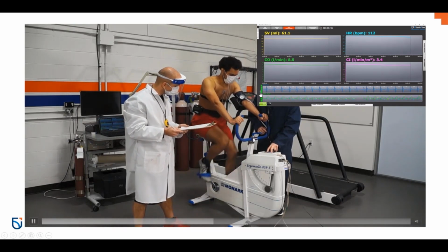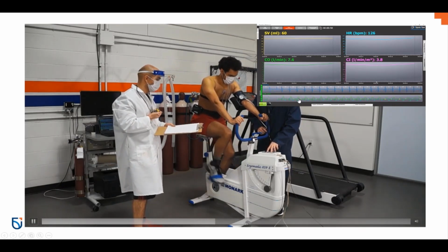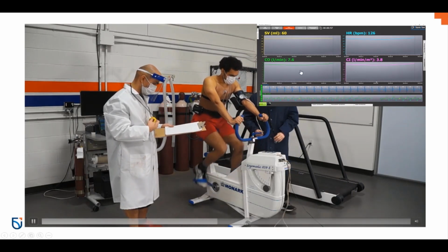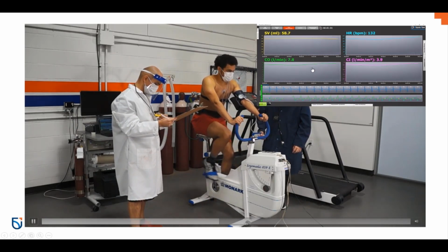This on the left here is the Bluetooth signal quality, and this here is the impedance cardiography, while here is his sinus rhythm from the regular electrocardiogram. So these will shift along and sort of crunch down as they normalize.